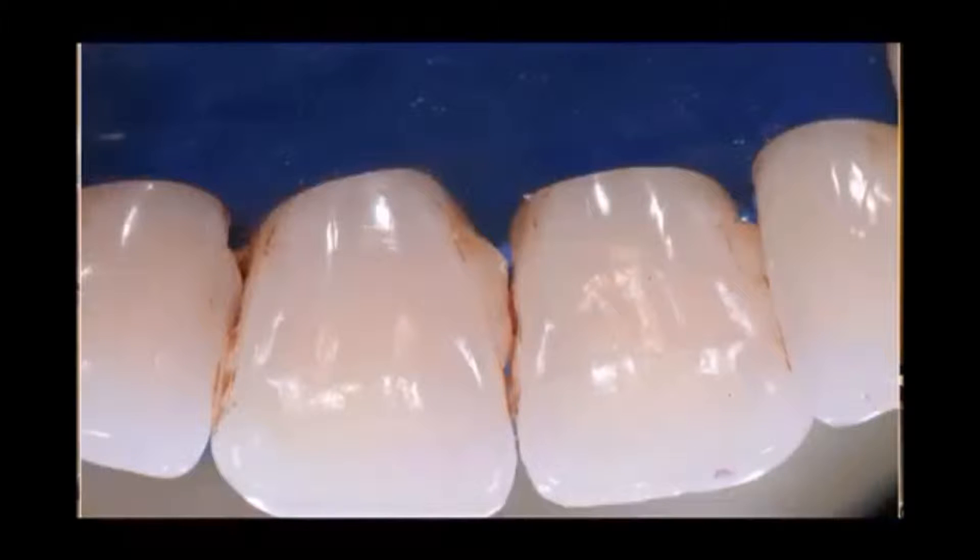Composite finishing is really different than anything else that we've looked at under the microscope. It's different than gold, acrylic, different than amalgam, porcelain — it's a completely different animal. We've put together a very interesting and beautiful way to do minimally invasive, infinity-edge, beautiful, natural-looking composite finishes.